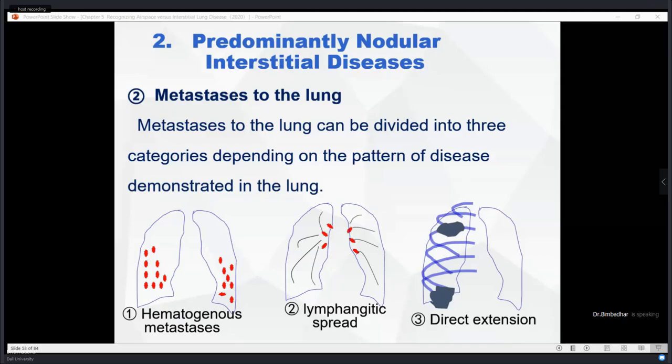Right, exactly. We will try to look at that. TB generally is not like metastasis, but they will be more heterogeneous and well demarcated. They will have a capsule. Adenocarcinoma generally will not have a capsule. We'll talk about it. The last topic in this one is TB itself, and then we will try to differentiate all three diseases. Don't worry, I will explain that.